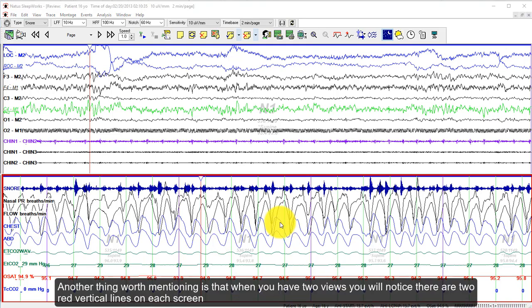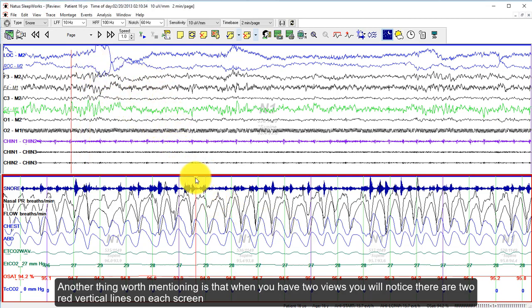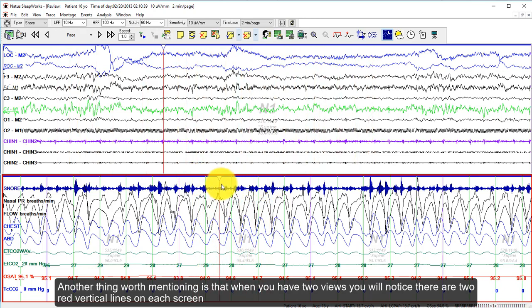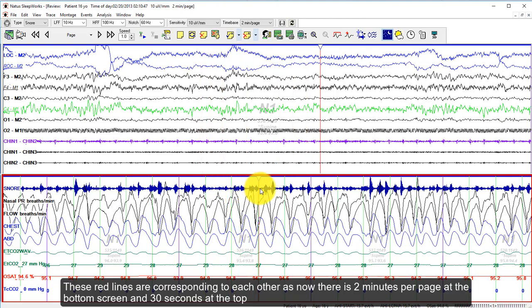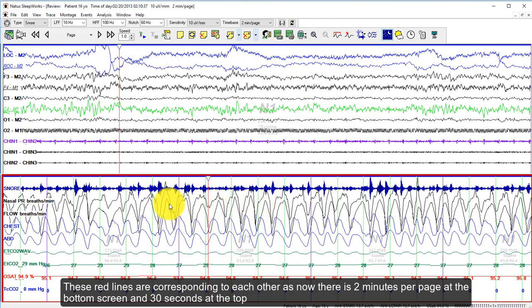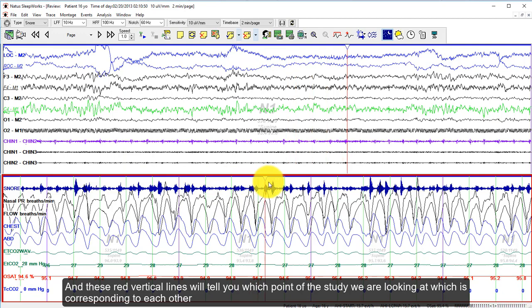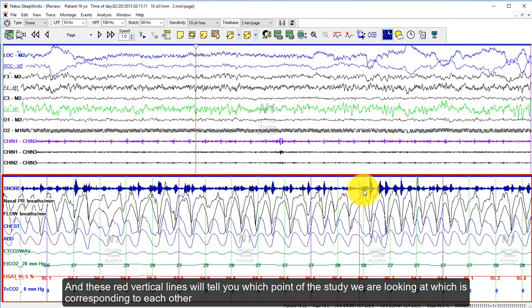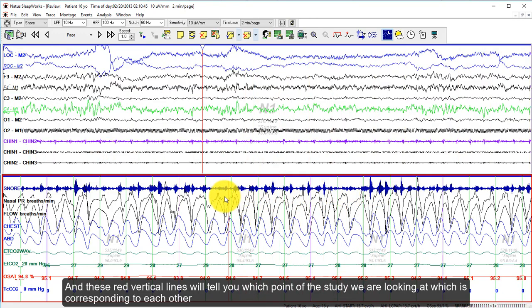Another thing worth mentioning is that when you have two views, you will notice there are two red vertical lines on each screen. These lines correspond to each other — because we have two minutes per page at the bottom and 30 seconds at the top, the red vertical line tells you the exact point you are looking at, corresponding between both screens.